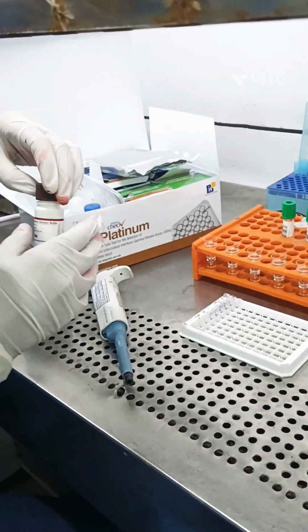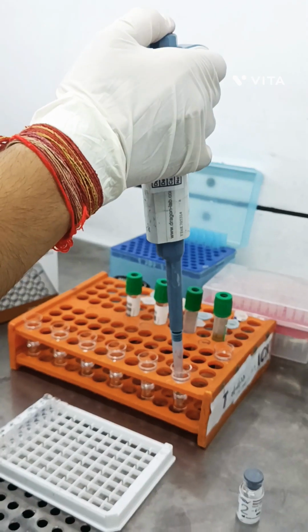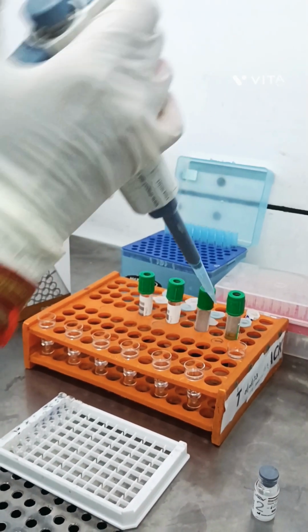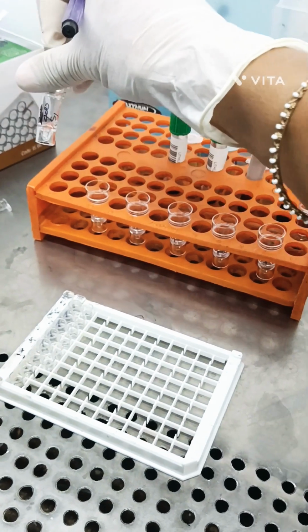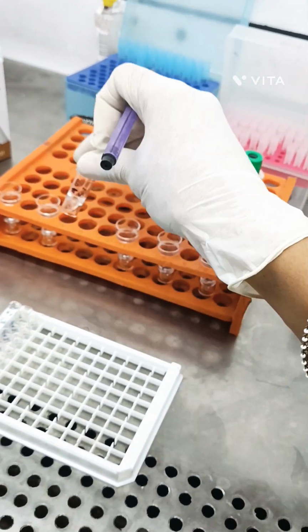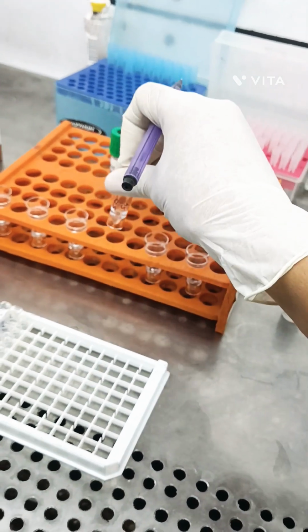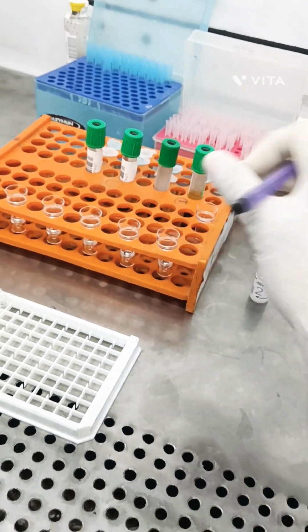Sample dilution is different and standard dilution is different. For standards only we are using standard dilution buffer. So the concentrations of this standard are 200, 100, 50, 25 and 12.5.